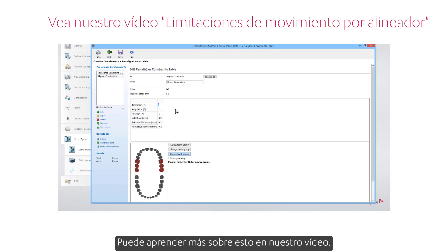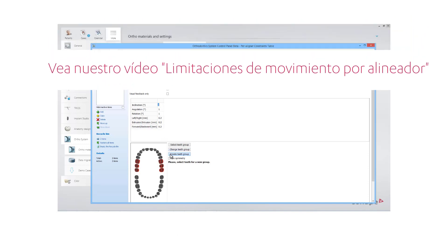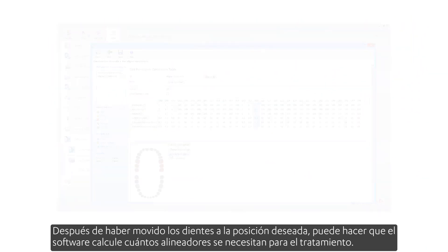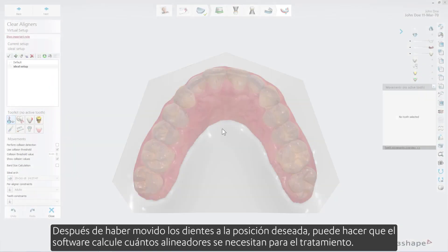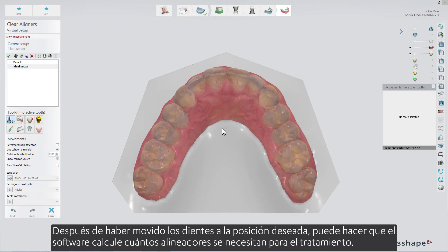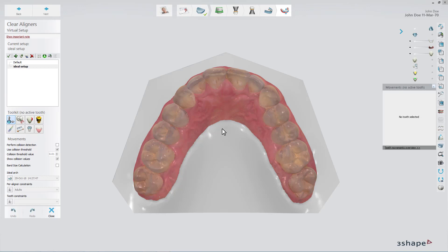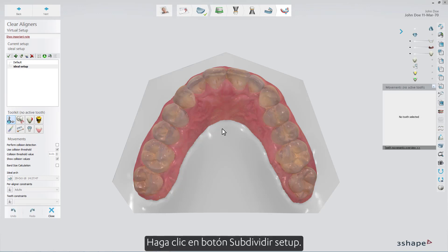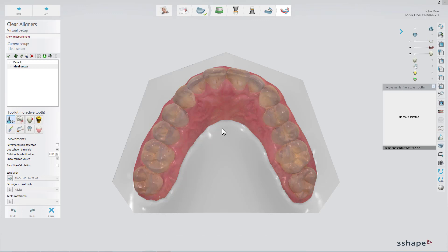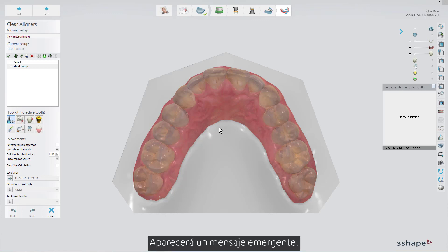You can learn more about this in our video. After you have moved teeth to their desired position, you can have the software calculate how many aligners are needed for the treatment. Click the Sub-Divide Setup button and a pop-up will appear.